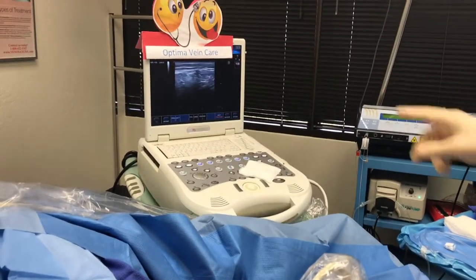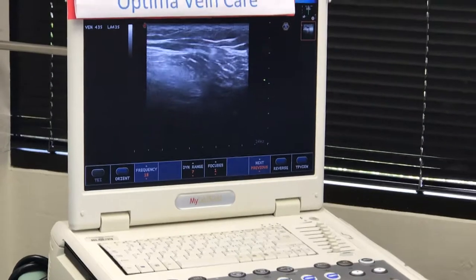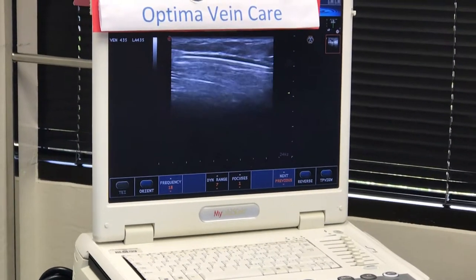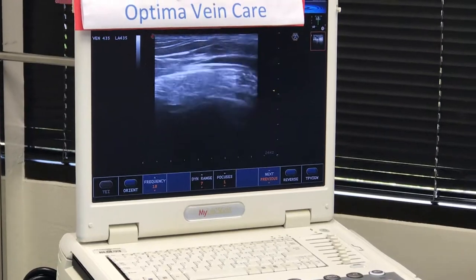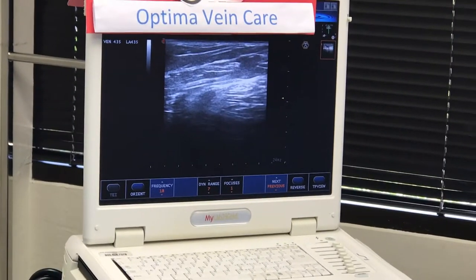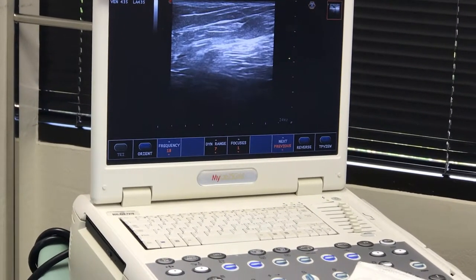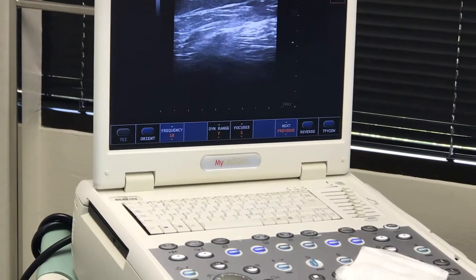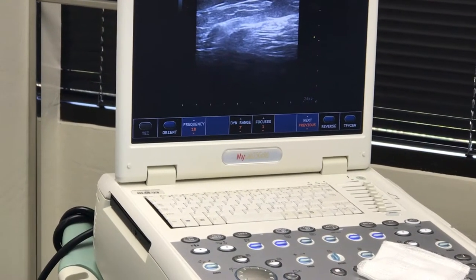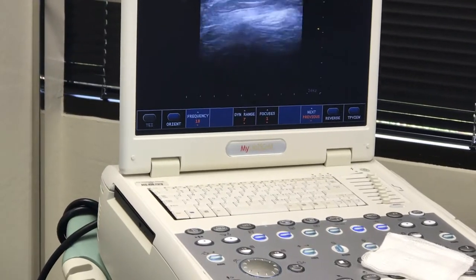I'll just check where the catheter is. You can see there's a little dropout shadow from the echo, and that helps to sight where everything is. Just working up the leg. Do you see the end of the catheter? There's the wire sliding in and out of the catheter — looks like a good position.